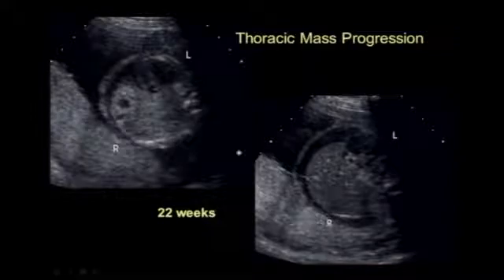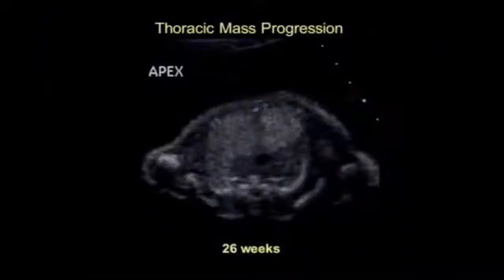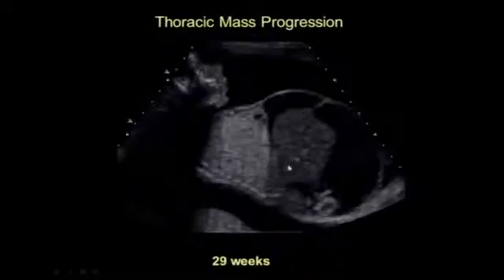In contrast, here's a fetus with a similar lesion at 22 weeks, and again, it's a very large right-sided lesion with a small cystic space in it, and the heart is pushed way to the left. But even at the time that we saw this fetus at 22 weeks, we could see that there was a pleural effusion, and then in the abdomen there is also ascites outlining the liver. That was 22 weeks. When the fetus came back at 26 weeks, the lesion is bigger. You can see that it's crossed the mediastinum, crossed the midline in the superior mediastinum at the apex, and has gotten quite large. And by 29 weeks, the amount of ascites in the abdomen had increased significantly, and this fetus did not have a good outcome.